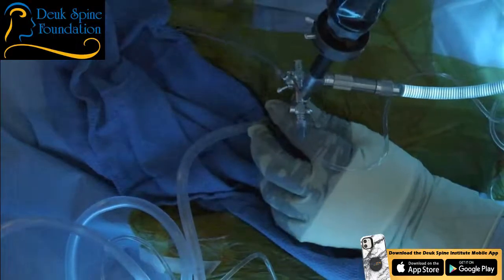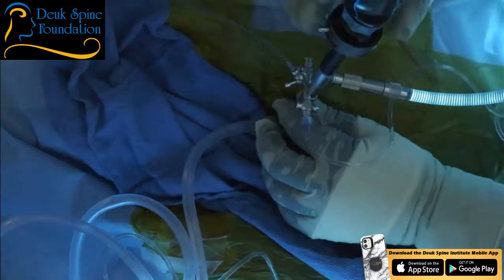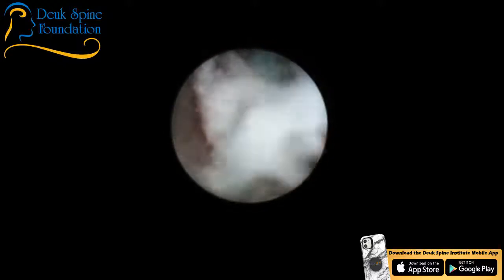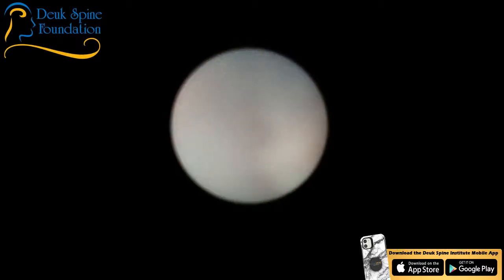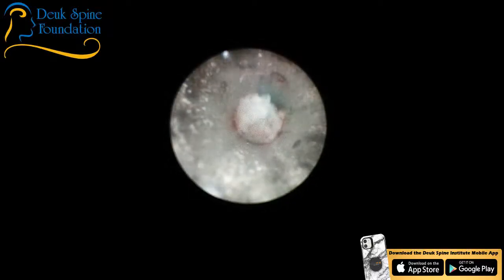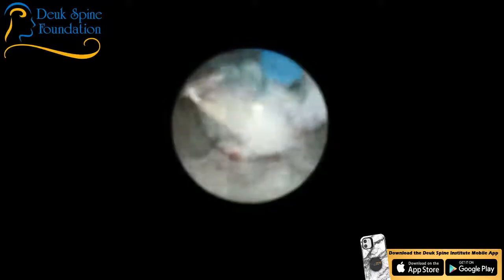Okay, let's see if we can get the picture on the television up there, please. What's going on, folks? We do it the same way every time, guys. Be ready. Be ready. Endo. All right. No, nothing yet. There we go. Something's happening. All right, good. Okay, so we're inside the herniation. We're at the base of the herniation.